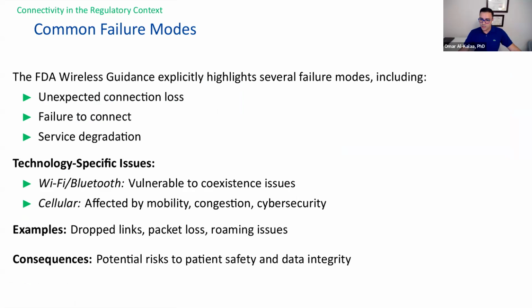Because we're talking about risk, then naturally we should be talking about the failure modes that come with integrating a wireless or connectivity module in a medical device. The guidance itself spells out several failure modes that are relevant in this area, like unexpected connection loss. And again, none of this is technology specific. It's unexpected connection loss in general. So how your particular connectivity modality might experience this is something that you should be thinking about.